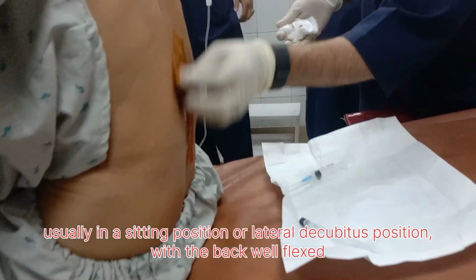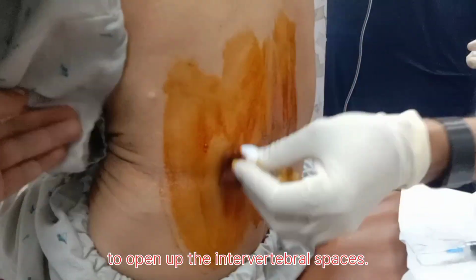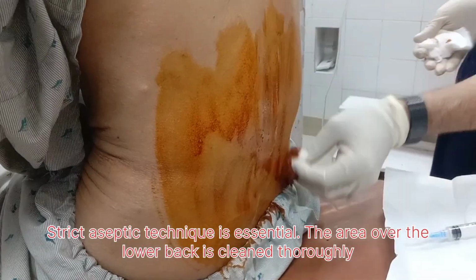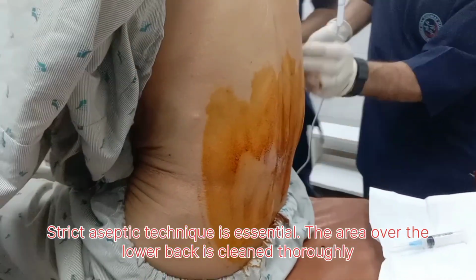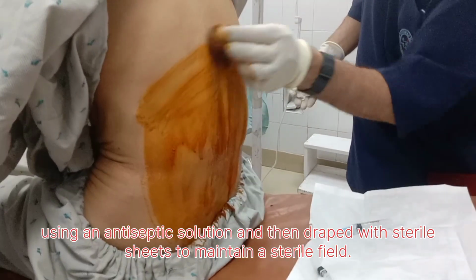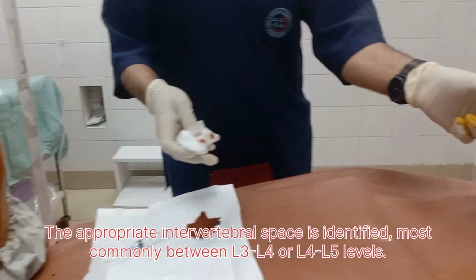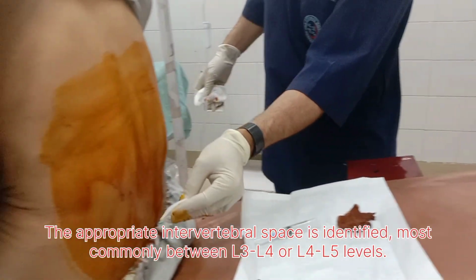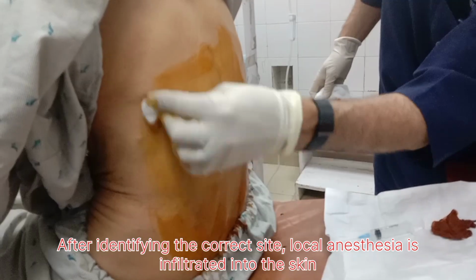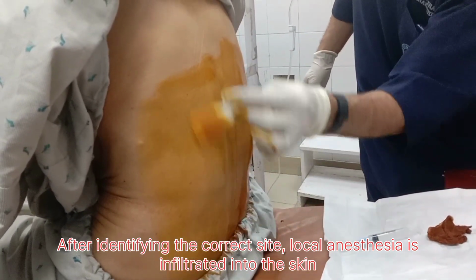The area over the lower back is cleaned thoroughly using an antiseptic solution and then draped with sterile sheets to maintain a sterile field. The appropriate intervertebral space is identified, most commonly between L3, L4 or L4, L5 levels. After identifying the correct site, local anesthesia is infiltrated into the skin and subcutaneous tissue to minimize discomfort for the patient. Once the area is adequately anesthetized, a spinal needle is carefully introduced in the midline.